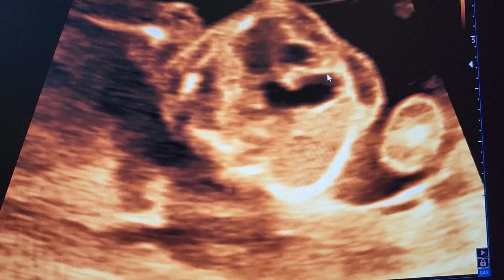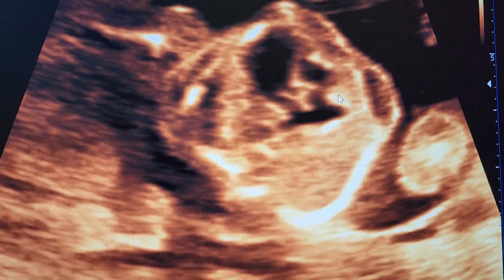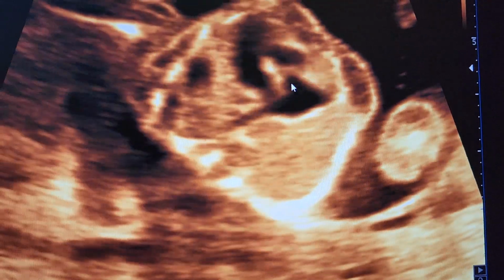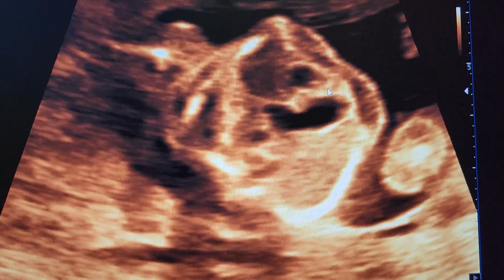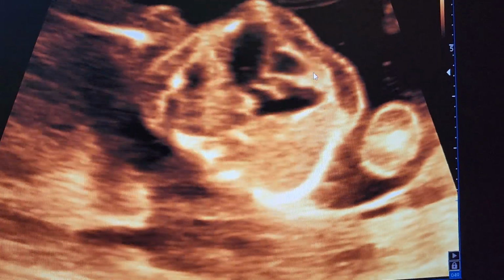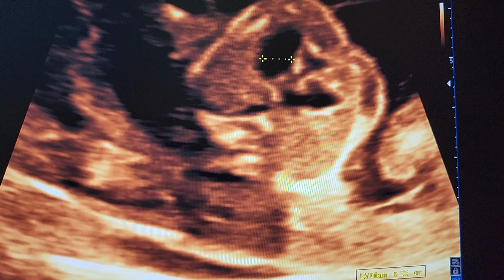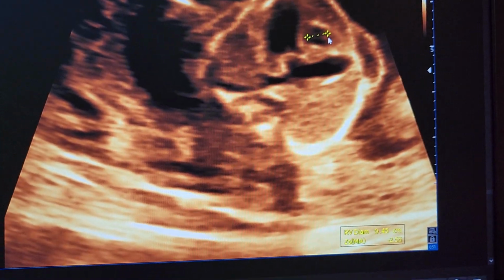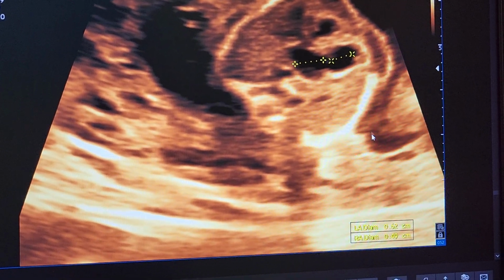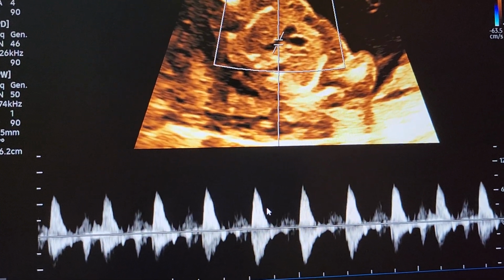So now we are scrutinizing the 2D abnormalities of the valve. You see the mitral valve is opening nice and wide, whereas the tricuspid valve is moving and opening very little. Also the tricuspid valve is echogenic, the interventricular septum is echogenic, the free wall of the right ventricle is also echogenic. So probably there is also secondary endomyocardial fibroelastosis. Now that's the LV chamber dimension 5.5 mm, normal. That's the RV chamber dimension 4.5 mm, small, and LA and RA show 6 and 5 millimeters, which are normal. And this is the ductus arteriosus reversal, which has been sampled.